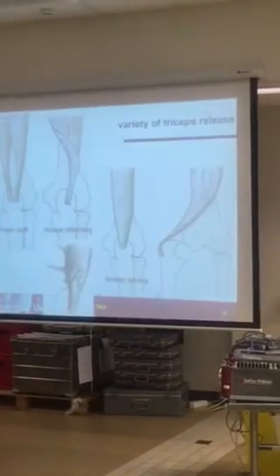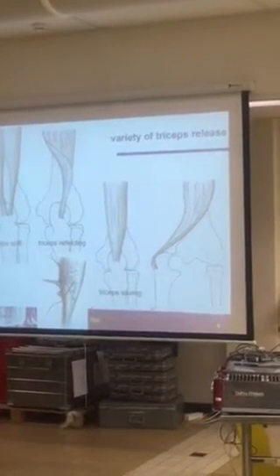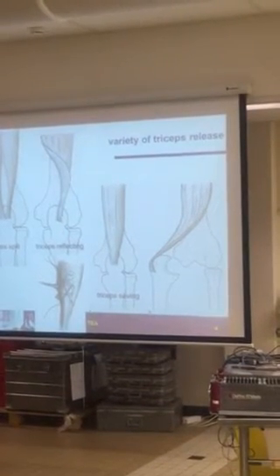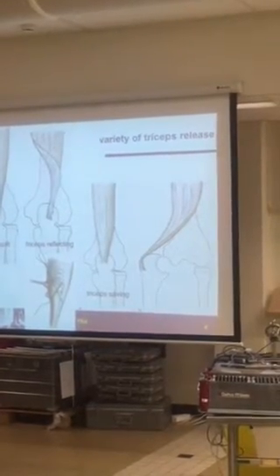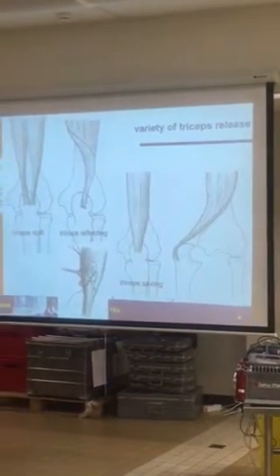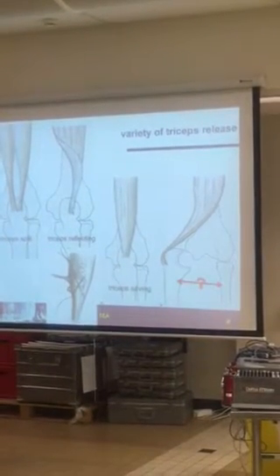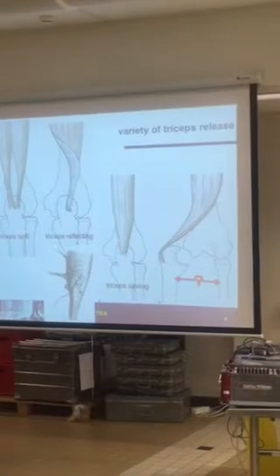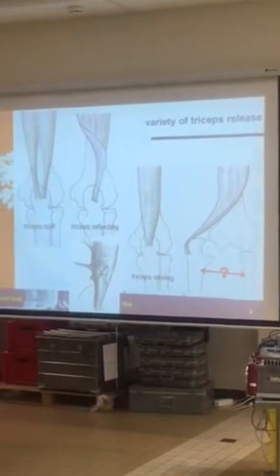So next, the triceps. What to do about that? Split, reflect, save. You see in the right slide there's something strange with the picture. This is what you can read in the book. But what about the distance between ulna and radius? It's strange that somebody has drawn this in this position.